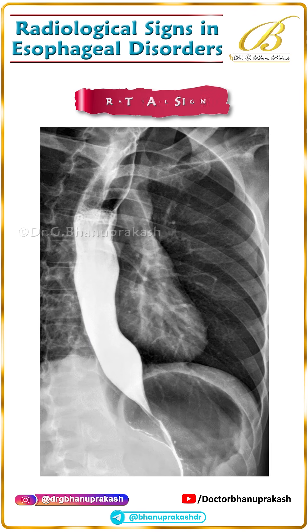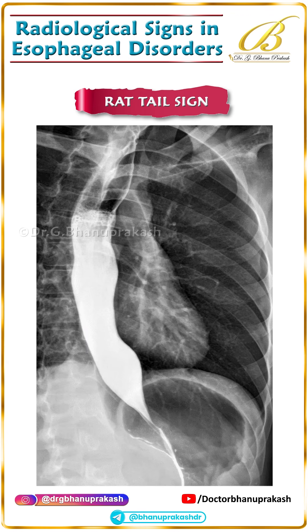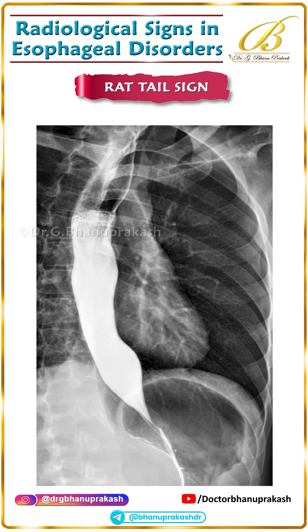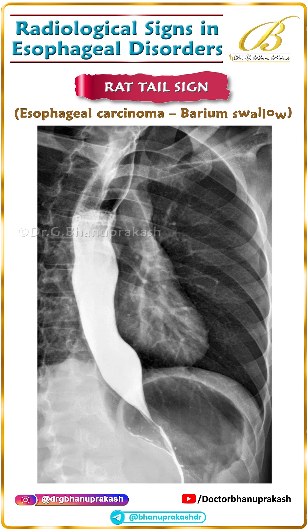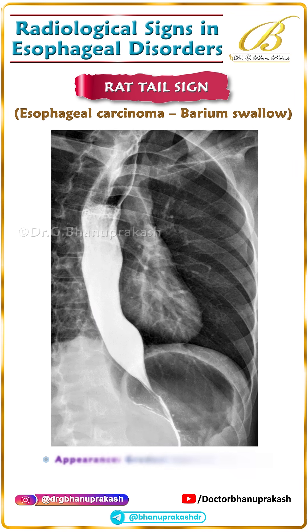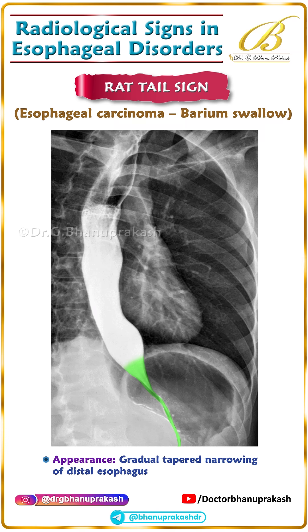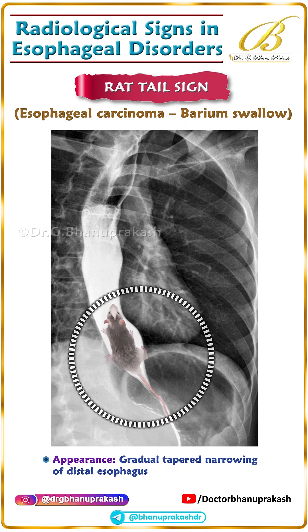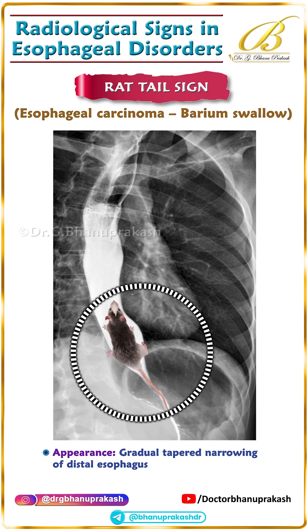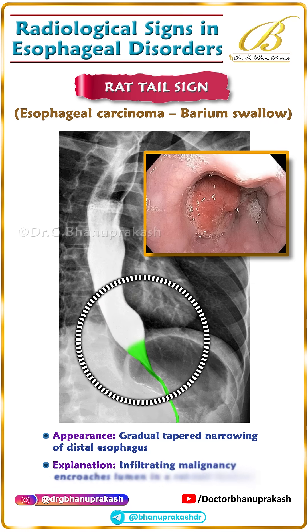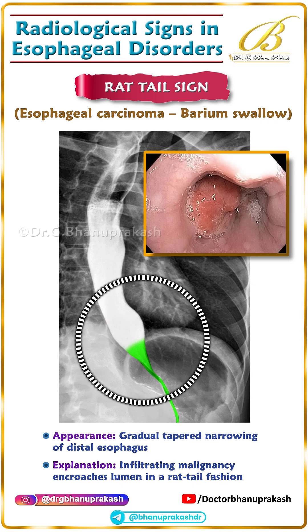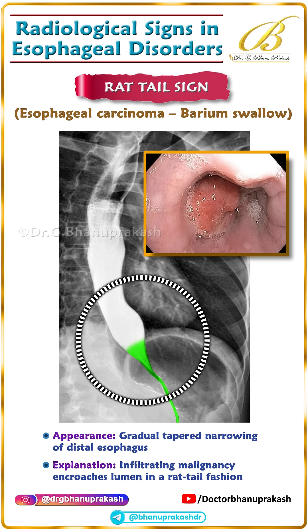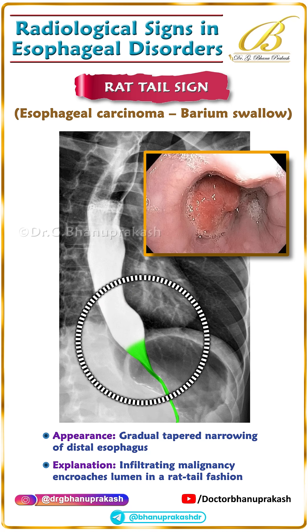Next, the rat tail sign. This is a hallmark of esophageal carcinoma. Here, the barium swallow shows a long, irregular tapering of the distal esophagus resembling a rat tail. It is produced by an infiltrating cancer gradually narrowing the lumen.